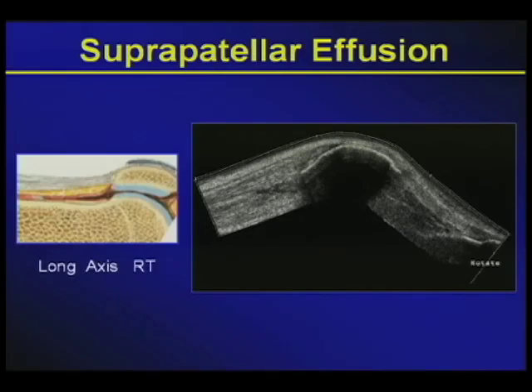Let's look at probably the window to the knee, wherein the suprapatellar bursa is where changes occur that you could more or less look at the knee superficially. But what is happening to the inside part of the knee is also very important. So effusion, crystal depositions disease, infection, and maybe even loose bodies, are intraarticular lesions, but they may express themselves in the suprapatellar region. The suprapatellar region is most famous, of course, for detecting and localizing effusion.